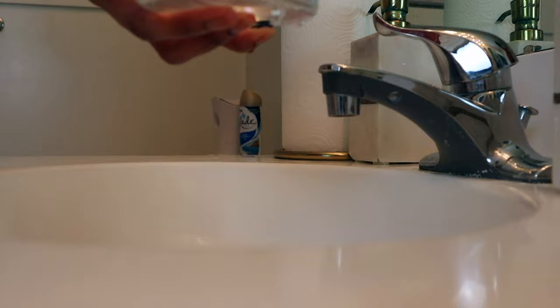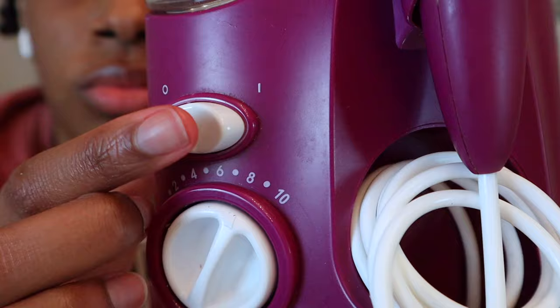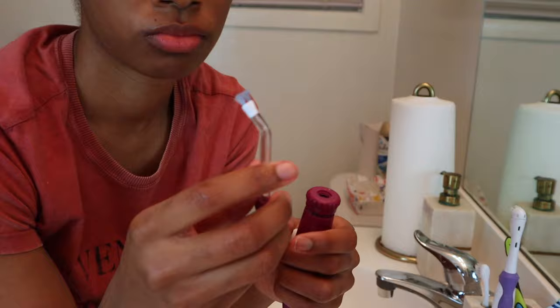So I'm just going to fill it up, place that back on the tank, close the top, and then turn the intensity that it pushes the water out. I'm going to turn it up to eight or ten. When you're first starting off you definitely don't want to go that high because it is very forceful. I've been using this for almost two years now so my teeth can handle it and I've worked my way up to that point.